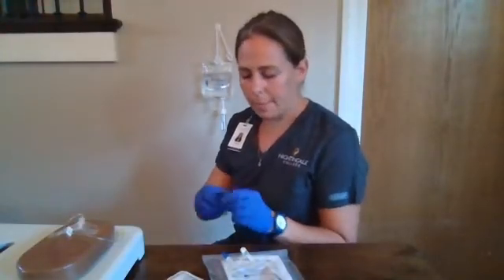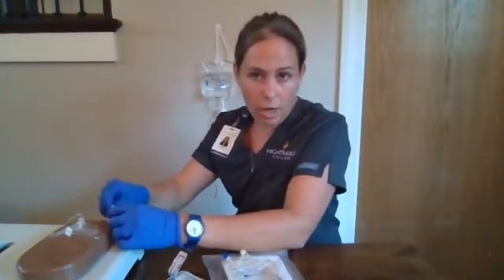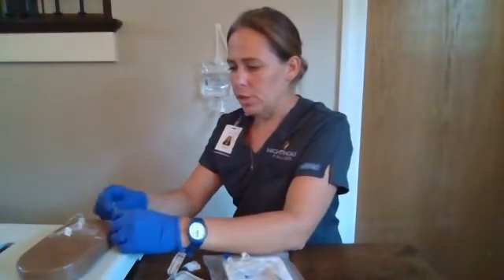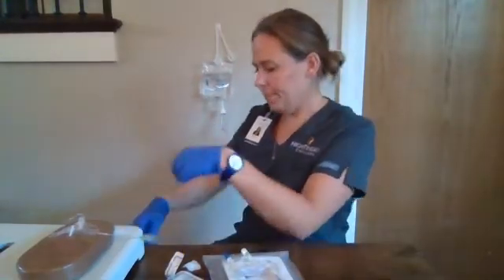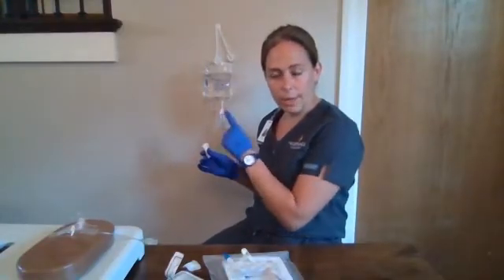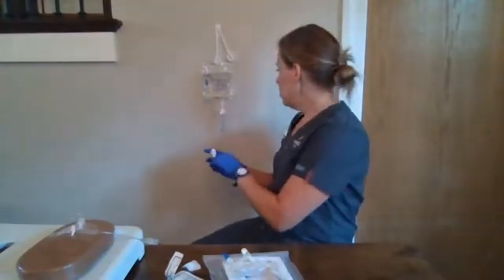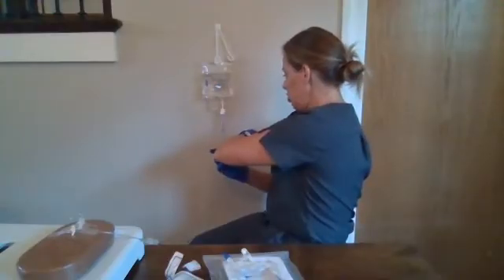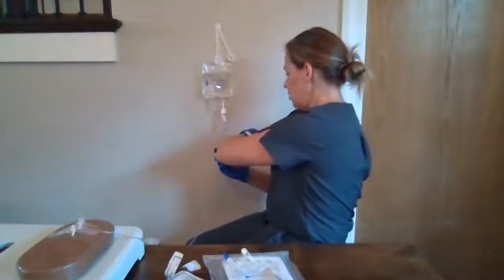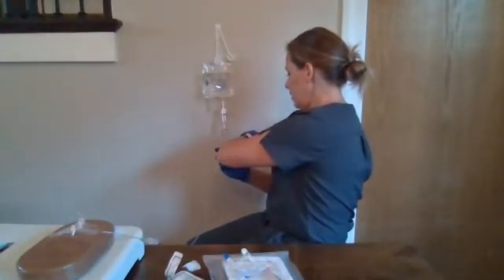Next, we're going to use our alcohol prep and clean our patient's IV site — their saline lock, however you are attaching it. We'll give it a minute to dry, and then we are going to attach our primary tubing. We're going to slowly open up our roller clamp and count our drip rate. For our primary infusion, we need 38 drops over one minute. We will time it, adjust our flow rate to meet our drip rate, and then count that for one whole minute to verify accurate infusion rate.